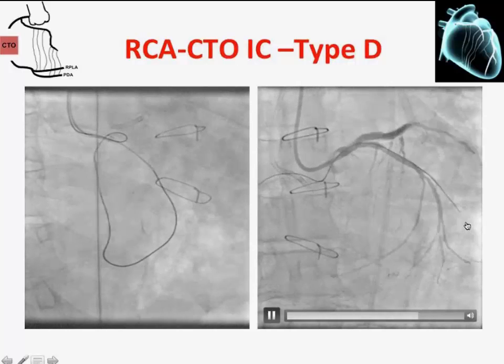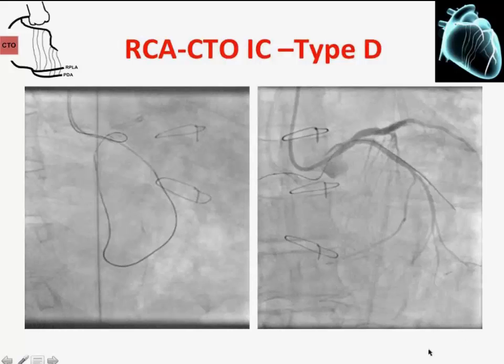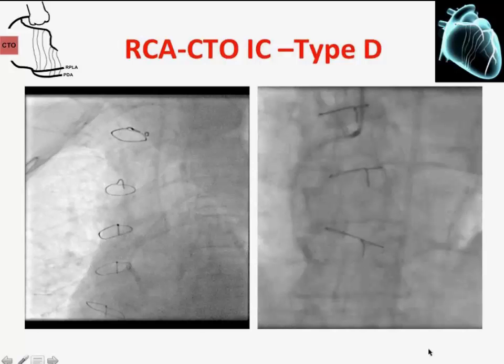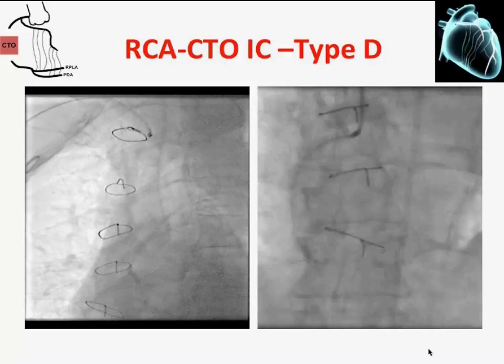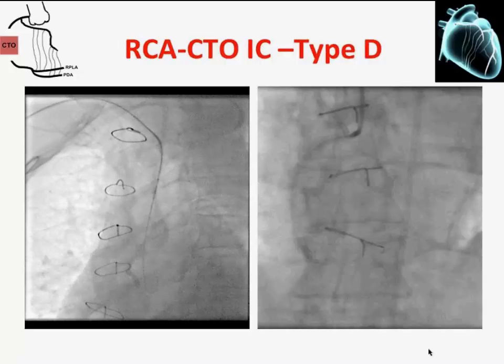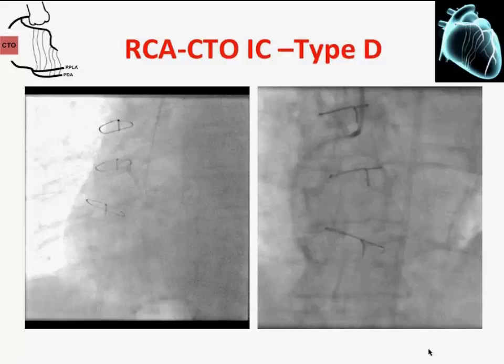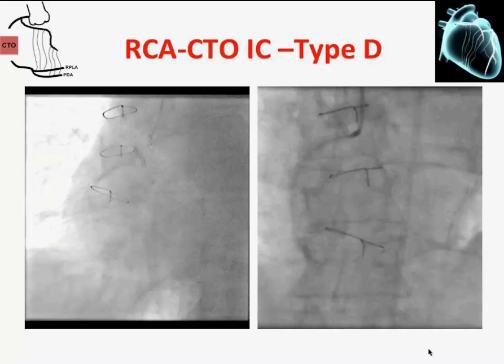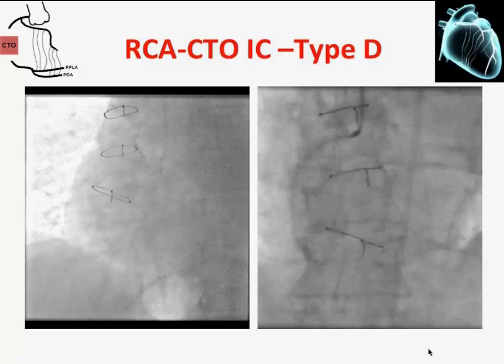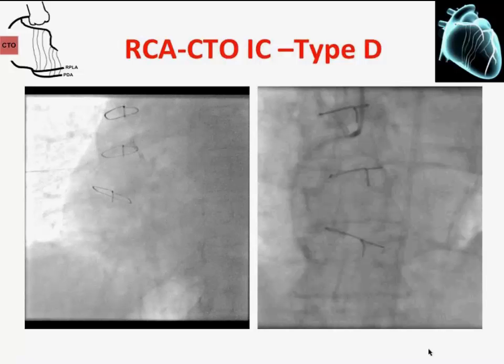So I was lucky that it didn't perforate at the marginal branch here, but I snared the wire in the truncus brachiocephalicus, and there I couldn't bring down the catheter, because there was such an obstacle, but with a second wire, it was with a normal wire, it was possible to guide. It was possible to bring the second guide down, and so we had also ping pong technique here, as you can see here.